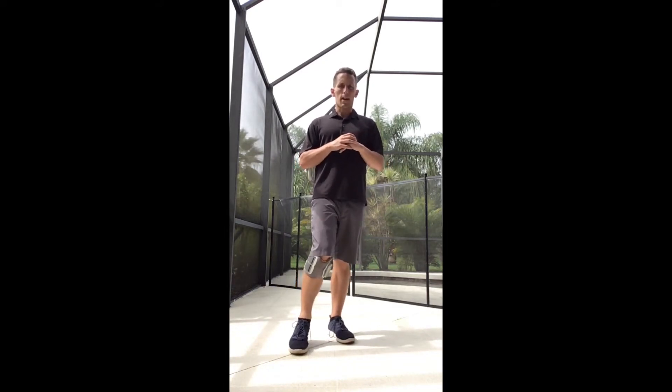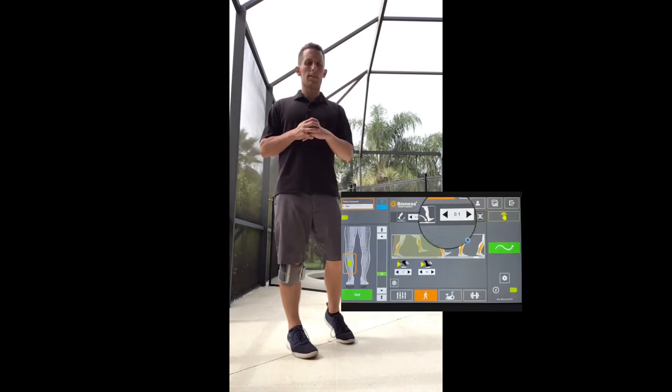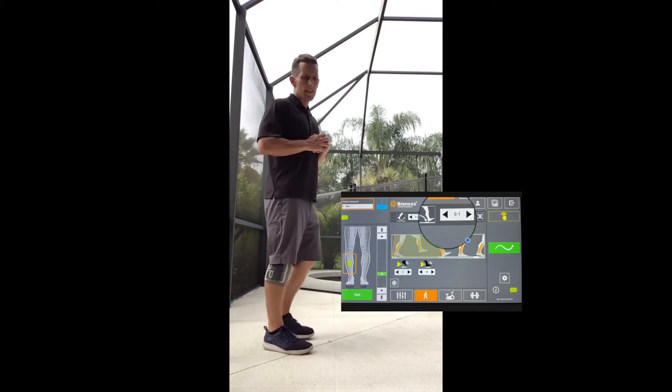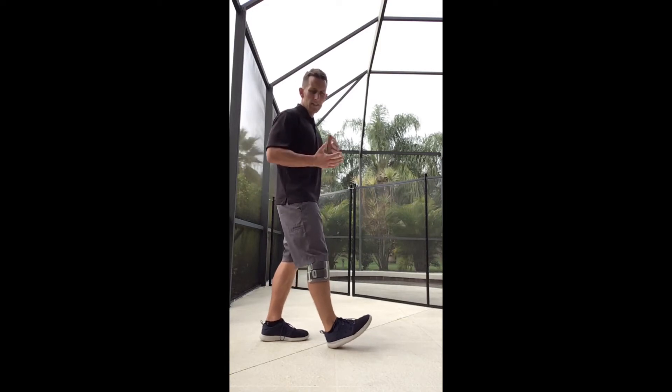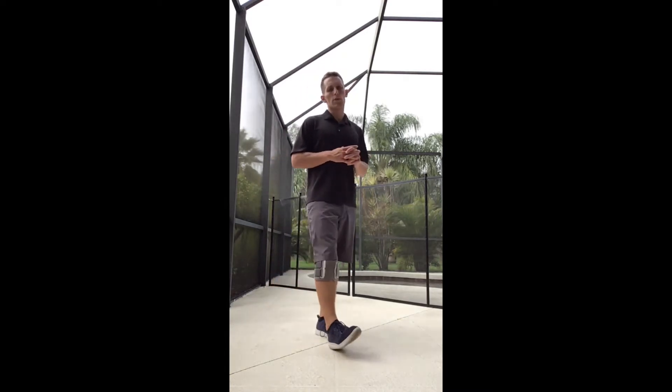To the right of that is the ramp down time, which also defaults at 0.1, but we will often increase that if we want to help with foot slap. So if everything looks pretty good but they're slapping during that eccentric portion, we can increase that up to 0.3 or 0.4, or whatever looks best for the patient while they are demonstrating their gait.